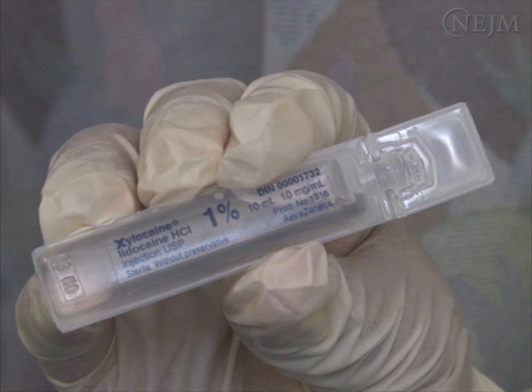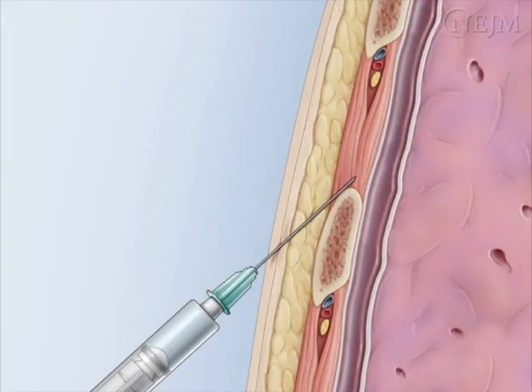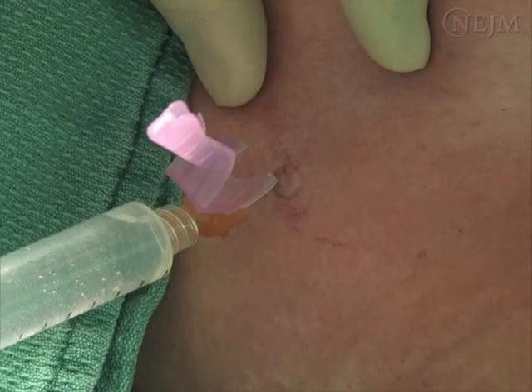Adequate analgesia is a very important step in this procedure, as chest tube insertions can often be very painful for the patient. The skin, subcutaneous tissues, deeper tissue layers, parietal pleura, and periosteal surface of the rib below the intended insertion site must be generously anesthetized.